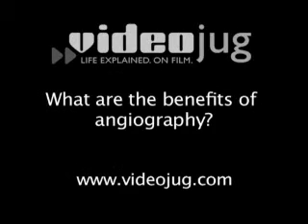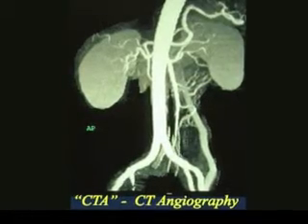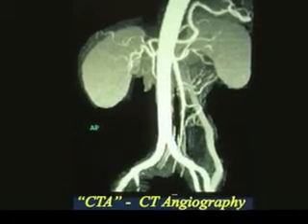What are the benefits of angiography? The benefits of an angiogram are that it allows us detailed images of blood vessels of the body. It allows us to, in a real-time fashion, see what the blood flow is like. We can also more strategically enter into smaller and smaller blood vessels in order to get more information about those small blood vessels. Not only that, if we do find an abnormality of a blood vessel, such as a narrowed blood vessel, we can perform procedures which open those blood vessels up at the same time.